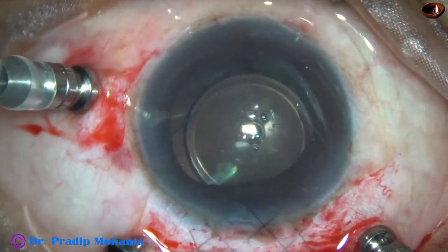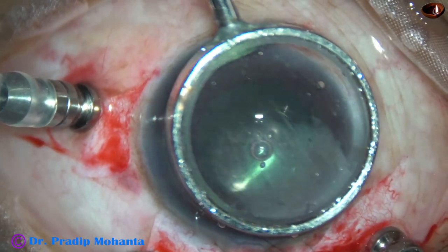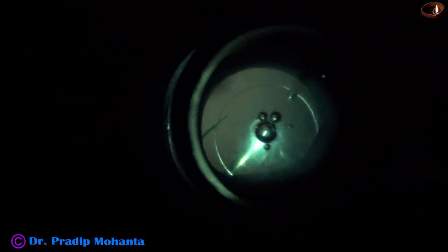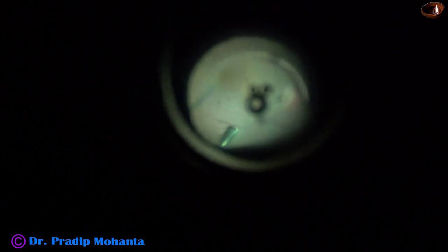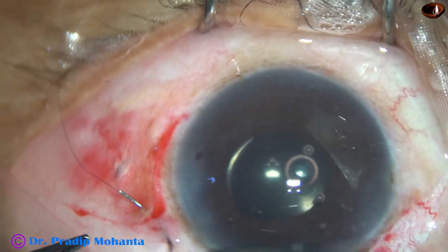I went again behind the lens — this is the last time I am going behind the lens. Why? Because I have used Viscoelastic and some of it has gone behind the lens into the vitreous cavity. I want to remove that nicely. If I do this, the intraocular pressure is likely to be normal in the postoperative period.